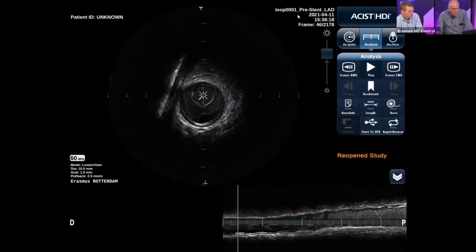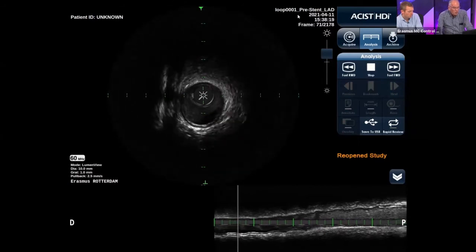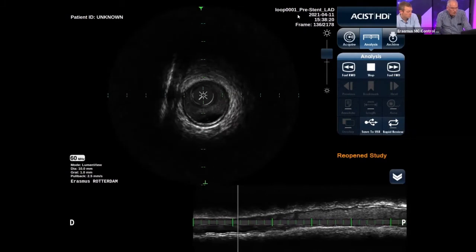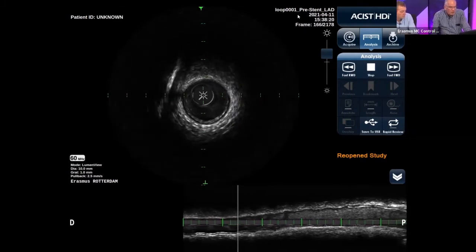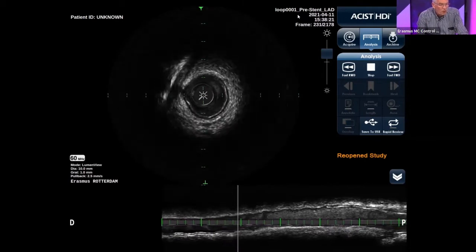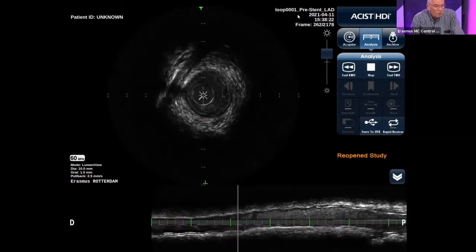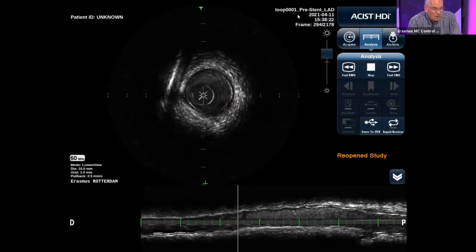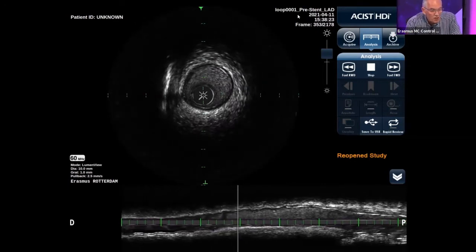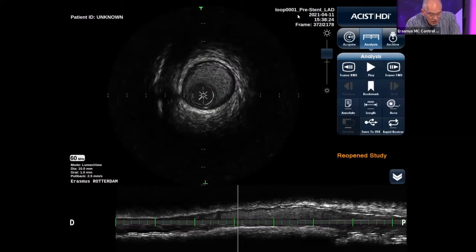That is the lumen. And because of that, more proximal in the stent, we're going to see that the thrombus is occluding the vessel, and we also see slow flow there. So we have a brighter blood speckling in the lumen, like what we can appreciate in here.